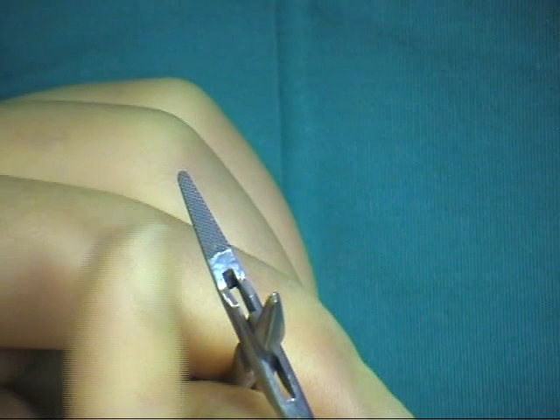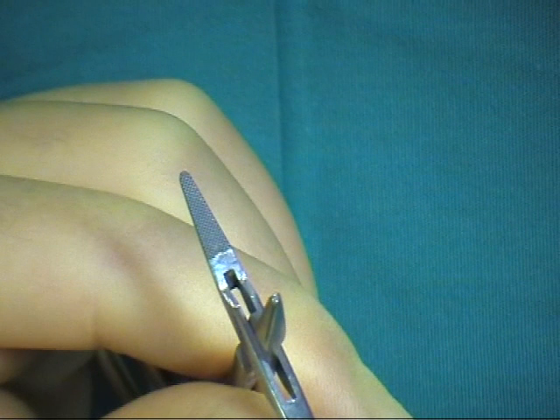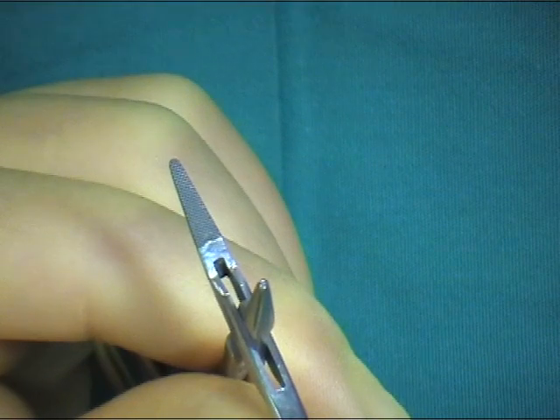Here we see the jaws of the needle holders, showing the serrations which are cross-hatched for maximum grip on the needle.